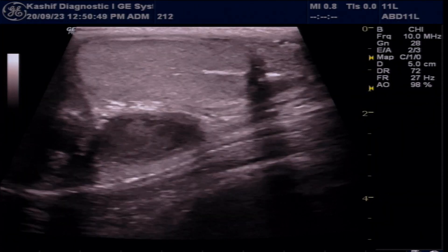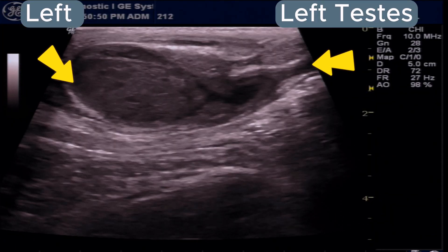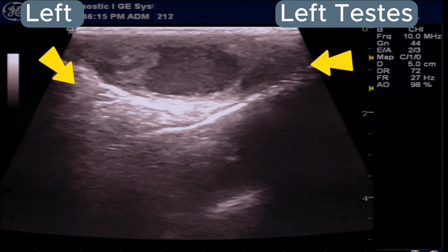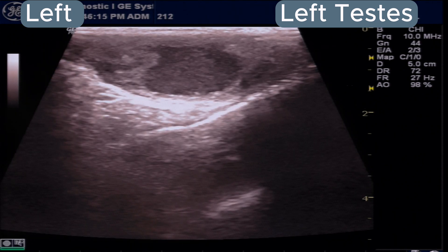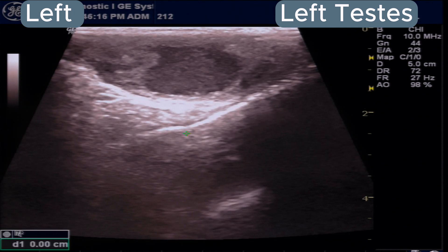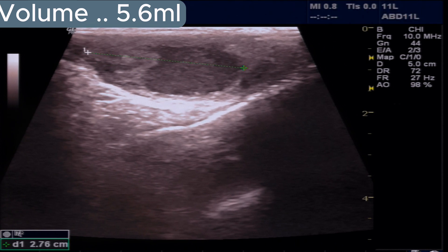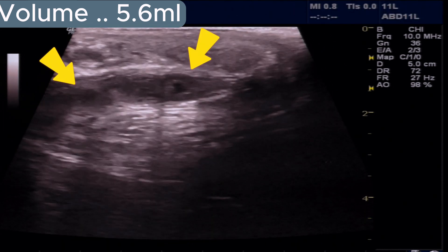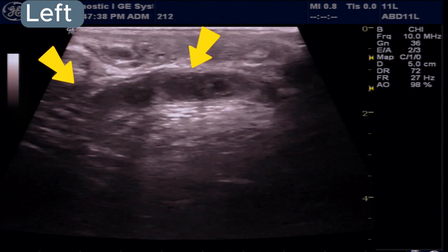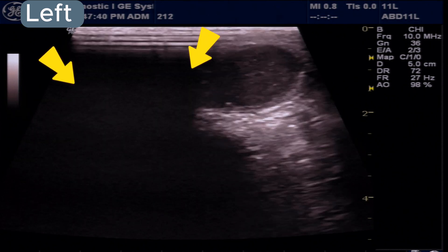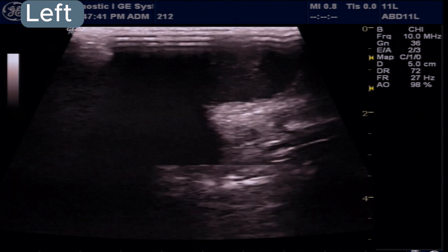On the left side we see another extra-testicular cystic mass with thick hyperechoic fluid, with a volume of 5.6 ml. There is also cystic thickening of the vas deferens in the lower third of the inguinal region.